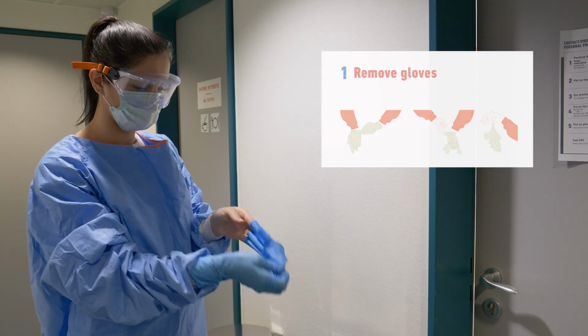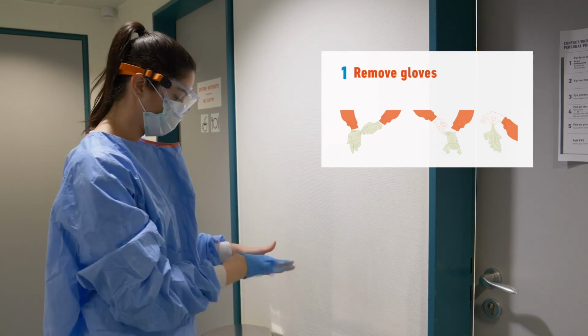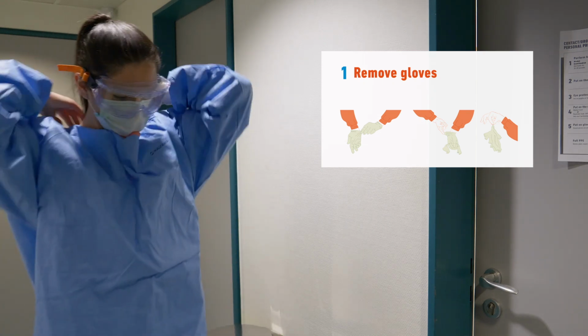The first step is to remove the gloves using the glove-to-glove and skin-to-skin technique. This is the most soiled item which needs to be removed first and discarded safely.